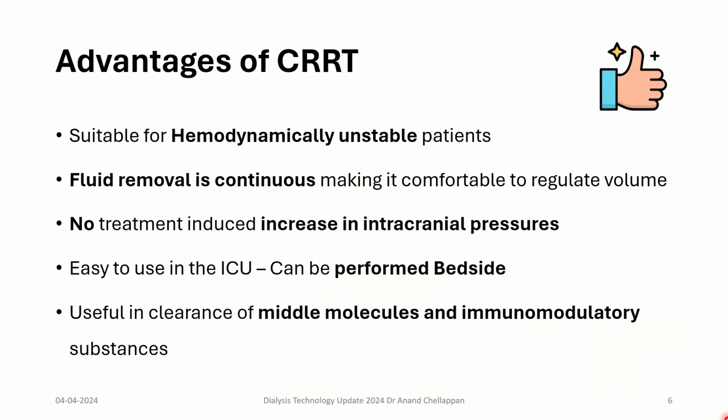Now, what are the advantages of CRRT? CRRT is suitable for hemodynamically unstable patients. For example, patients in the critical care units, in the ICUs, whose blood pressures are lower and inotropes, vasopressors are being used to maintain the blood pressure.